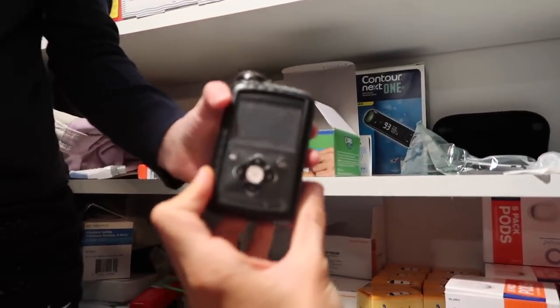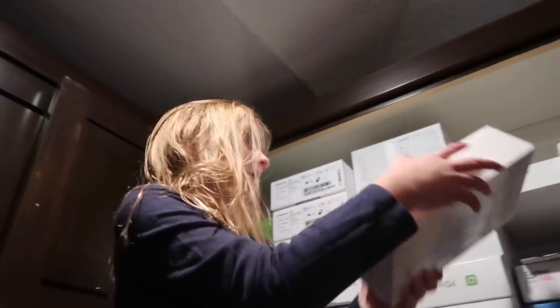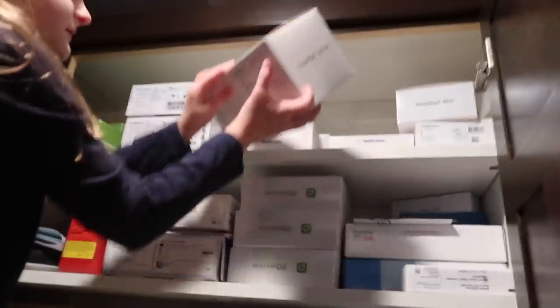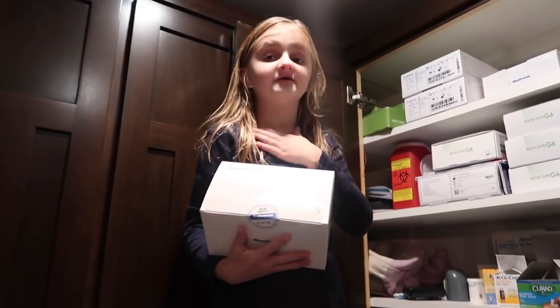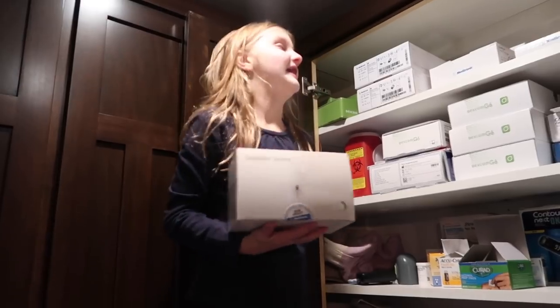This was her old pump, which we don't like, right? I like the Omnipod. Her Omnipod's right here. This was my little thing from the Guardian, but now I have the Dexcom G6, which I hate the Guardian.